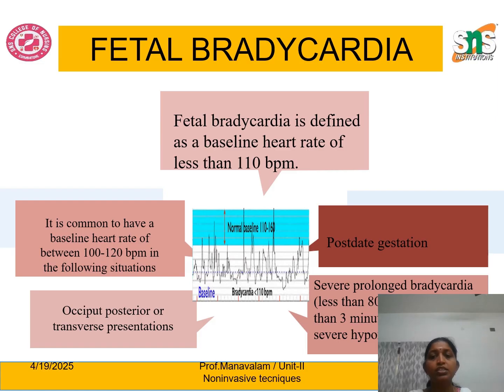Apart from that, in some conditions there may be a severe prolonged bradycardia. In that condition, the fetal heart rate goes below 80 beats per minute for more than 3 minutes. The main reason is fetal hypoxia.